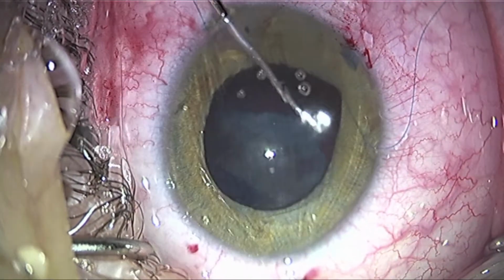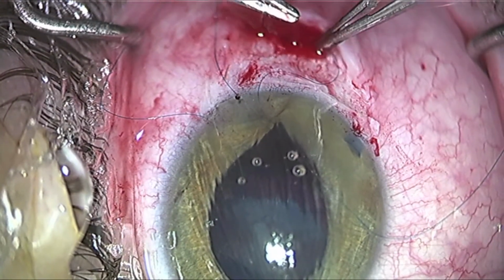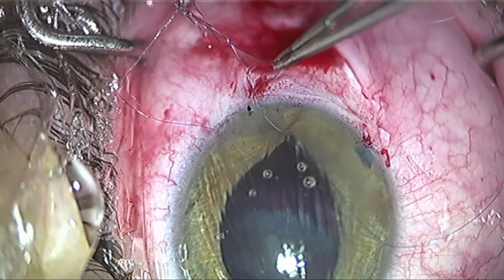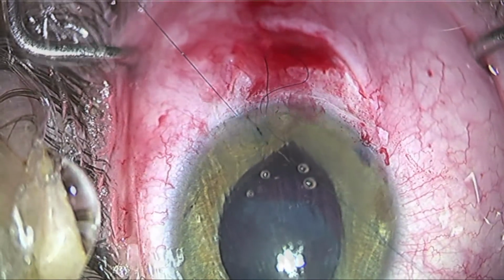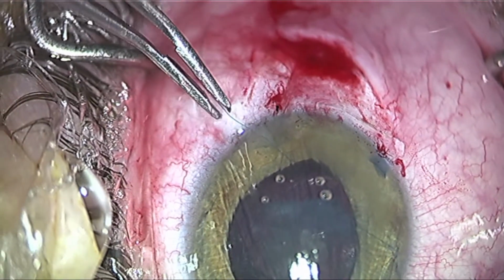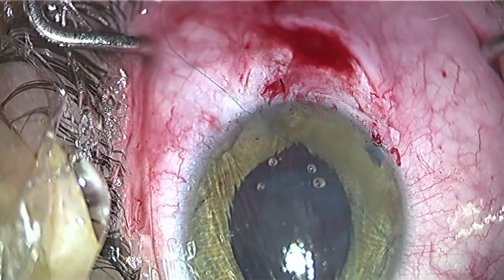Once the segment was in the correct position, I was able to go back in and bring out a loop of this other arm of the 9-0 Prolene and use a Siepser internal sliding knot to tie this down. And you'll see here that when the knot is cinched tight, it brings the entire lens over to its more anatomical position. You see that the Ahmed segment also comes over appropriately, and the whole lens is now shifting over to the upper part of the screen.